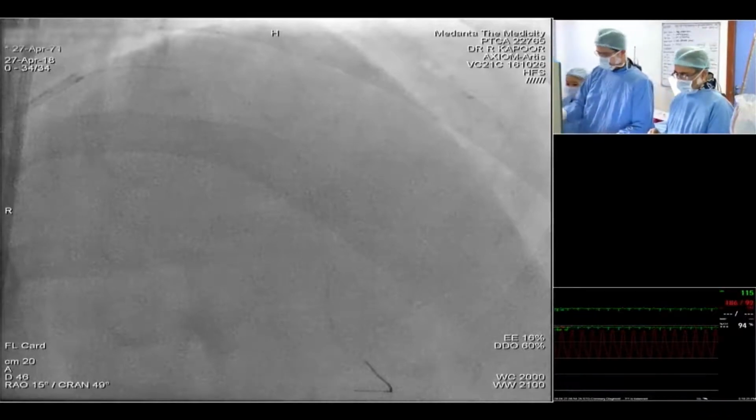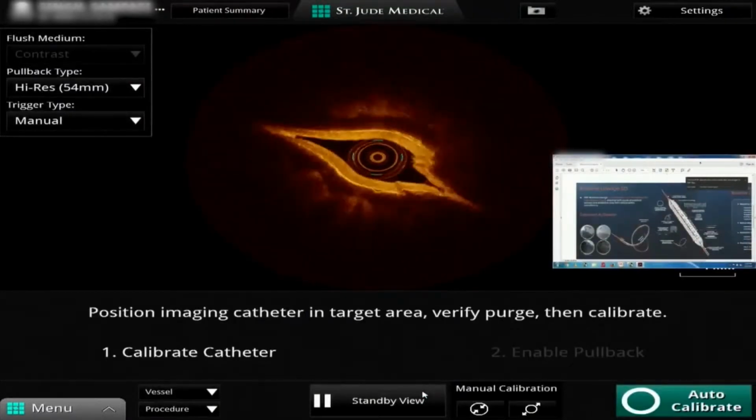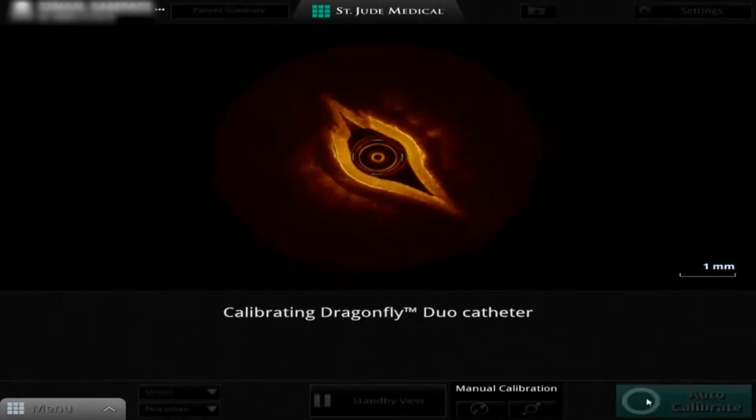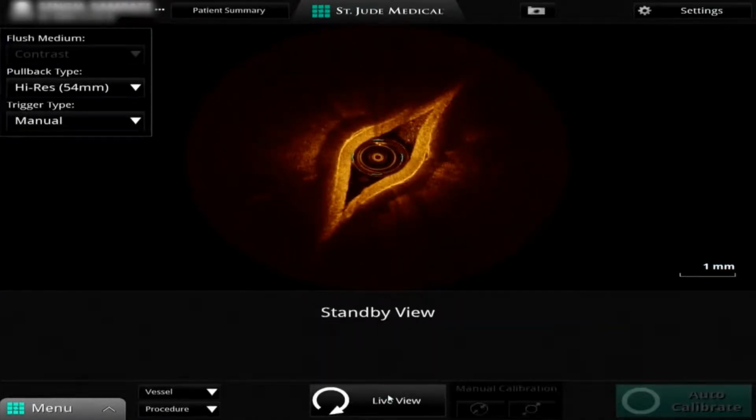So are you going to do the OCT for the LAD lesions and the left main in the same setting? Yes. And you will decide the strategy based on the result of the OCT, right? Yeah, practically we're looking at the left main lesion, how significant that is. Visually it looks around 30%, but let's see the OCT analysis. And also the length of the LAD lesion, it seems to be quite a long lesion, maybe more than 50 millimeters.